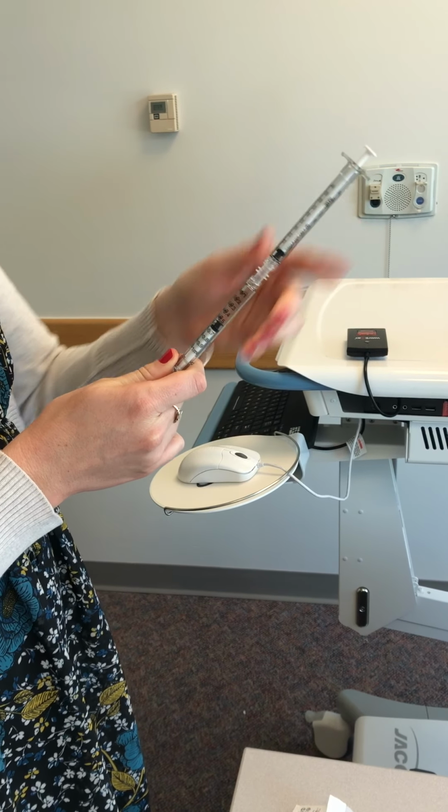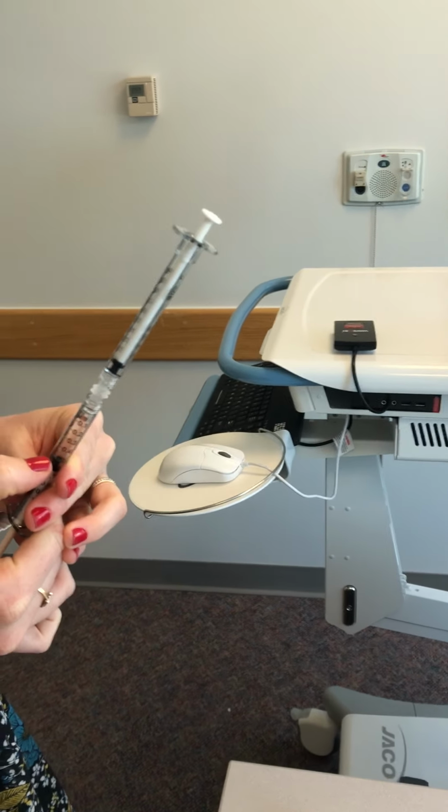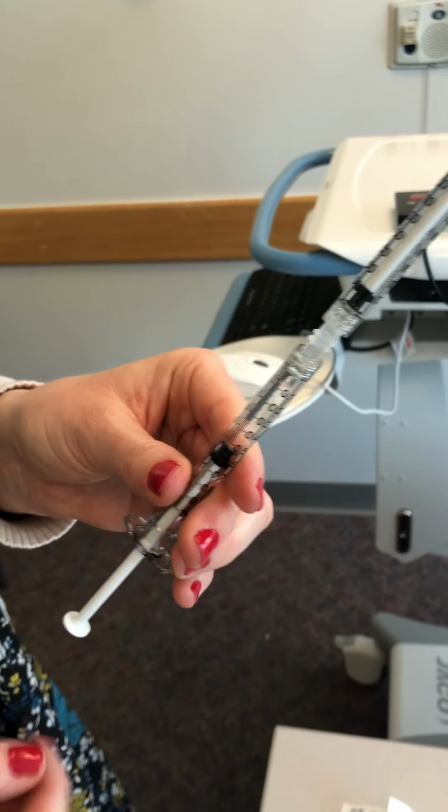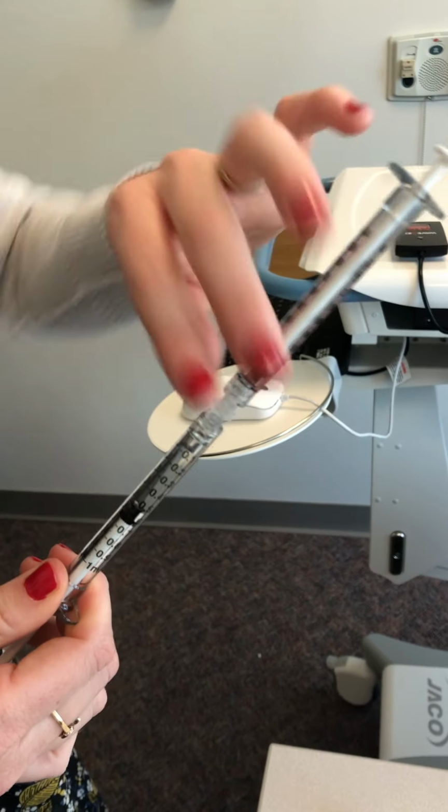So then we have our total volume to be delivered of 0.52 mLs, and I'll get a blue cap and label it, and then I'll be ready to give it to the patient. Perfect. Looks great. Thanks, Val.